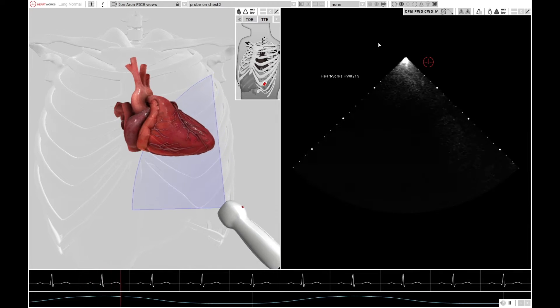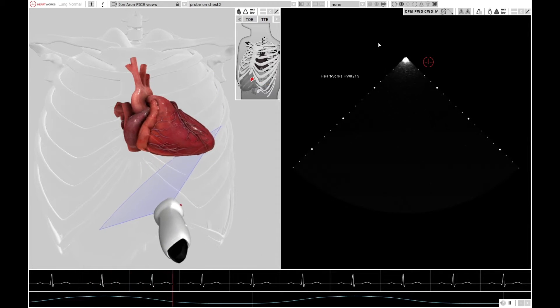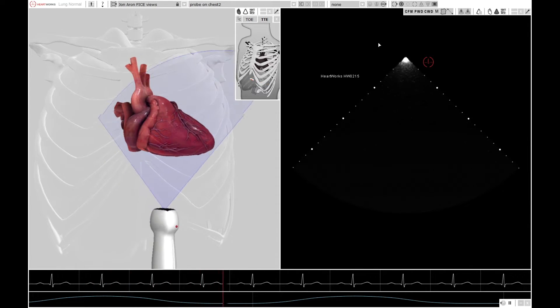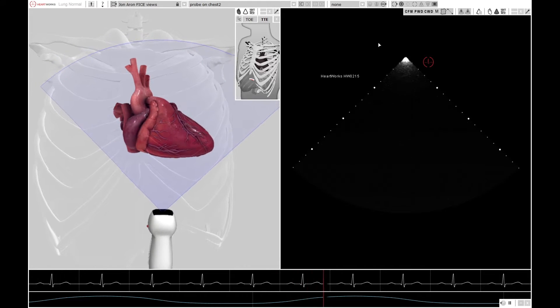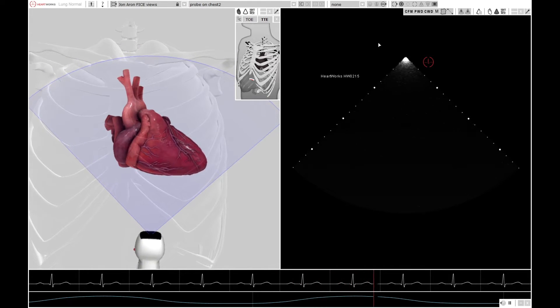And that completes your scan. Clean your machine, save your images, write your report, and congratulate yourself on a job well done.